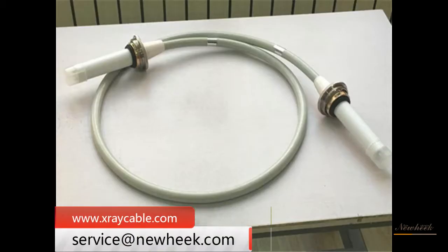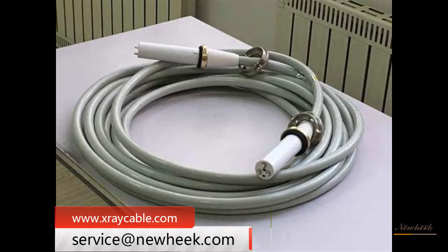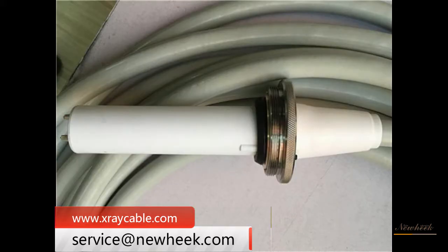An X-ray machine is generally composed of an X-ray tube, high-voltage generator, control equipment, cooler, mechanical equipment, and high-voltage cable.